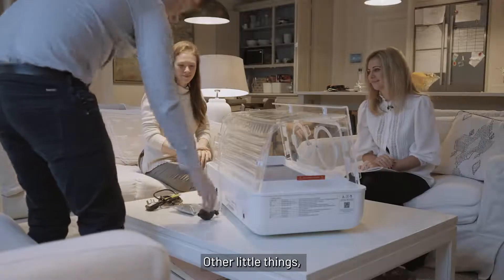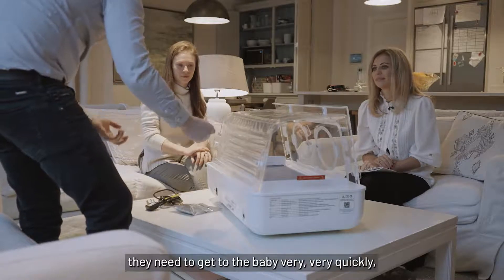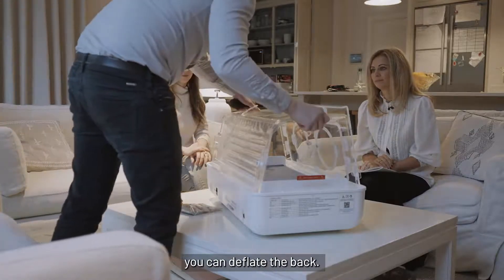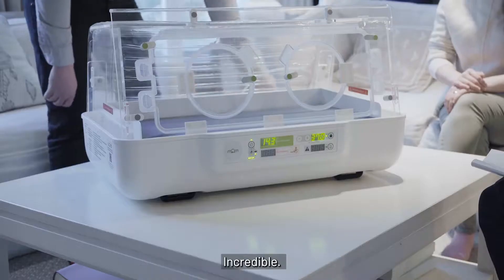If there are other little things — if there's an emergency and they need to get to the baby very quickly — you can deflate the back and lift the entire thing off the top and get the baby out. It's incredible. Wonderful.